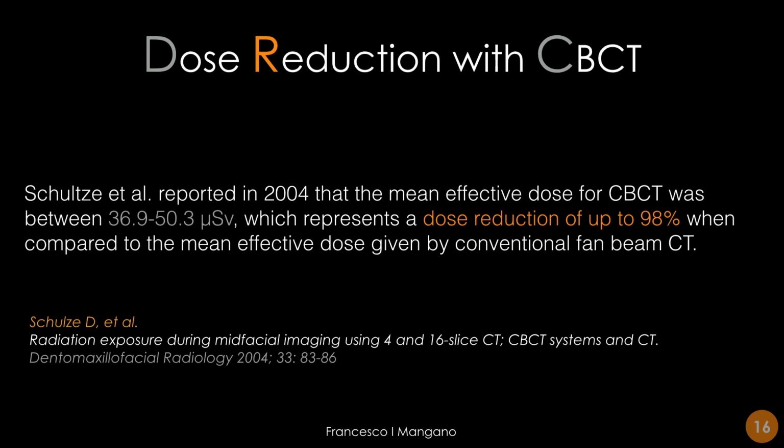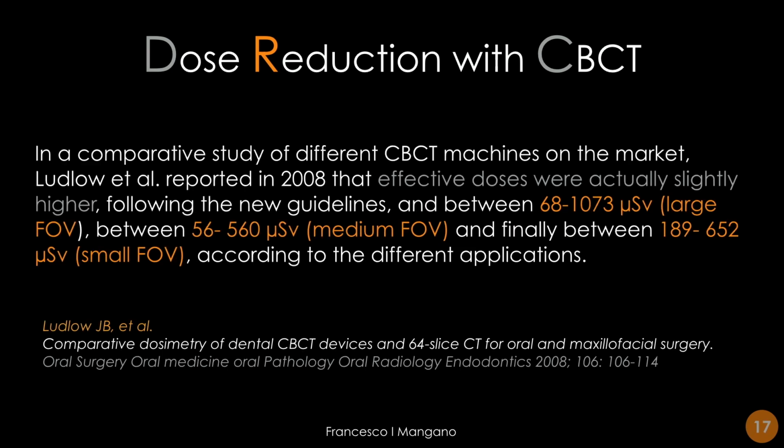And obviously we have a significant dose reduction with CBCT when compared to the medical CT, a dose reduction that, according to Schulze and colleagues in this paper published in Dentomaxillofacial Radiology in 2004, is up to 98%. So we are talking about something that is definitely not possible to discuss, because it's something obvious.